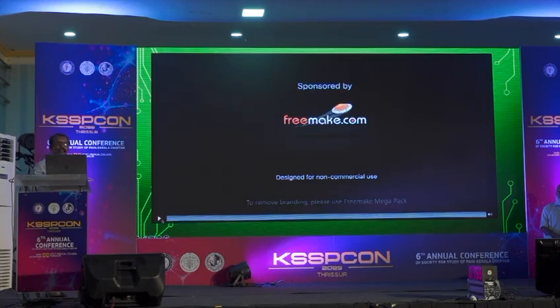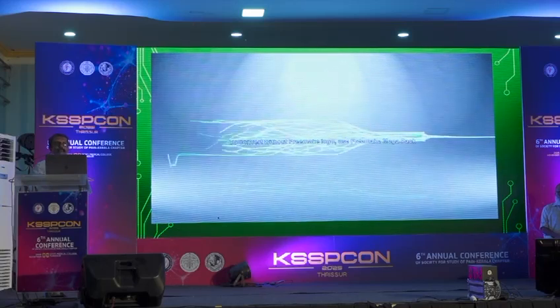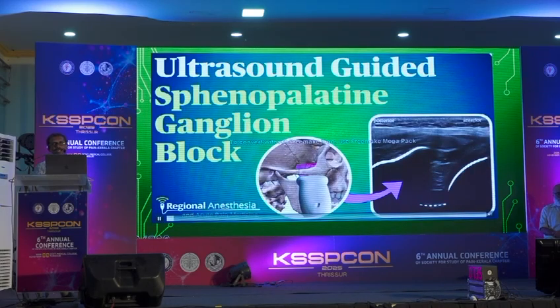This is a YouTube downloaded video. This is to demonstrate the pterygopalatine fossa injection. Practically, this can be done for post-surgical pain. When you are doing surgery in the mandibular or maxillary nerve territory, you can give it for post-operative pain relief. So that is the only utility of this particular block.